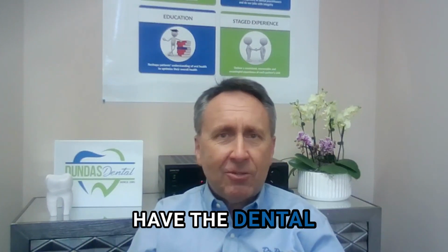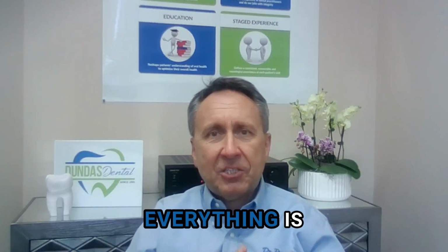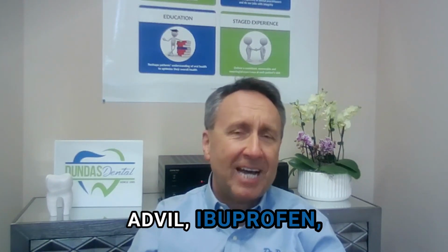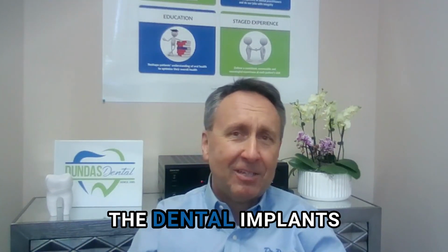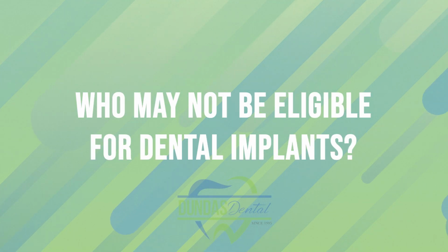When they come to have the dental implants placed, there is freezing or a local anesthetic placed. We put the implant in, and then afterwards, everything is sutured up, cleaned up. You may need some painkillers such as Advil, ibuprofen, Tylenol, and then most people forget that they have the dental implants placed.